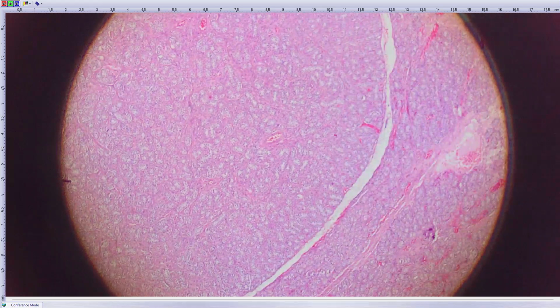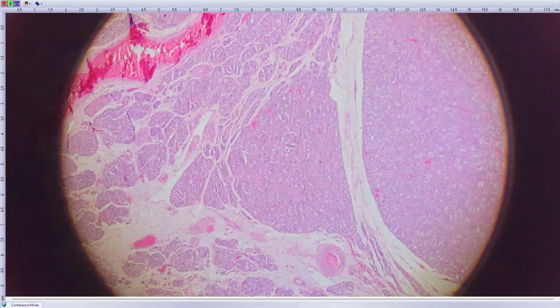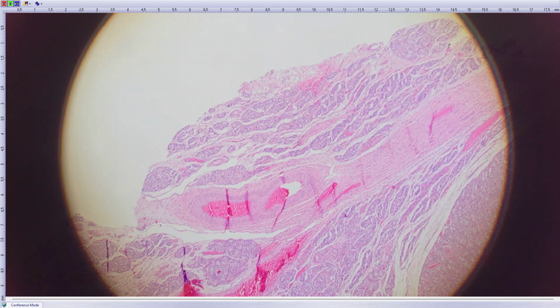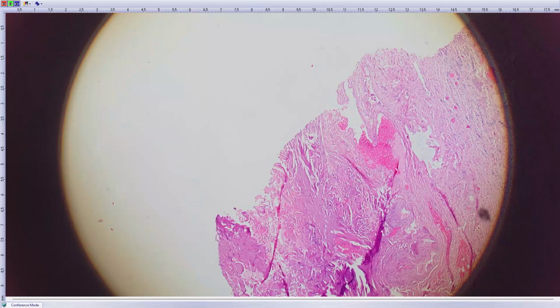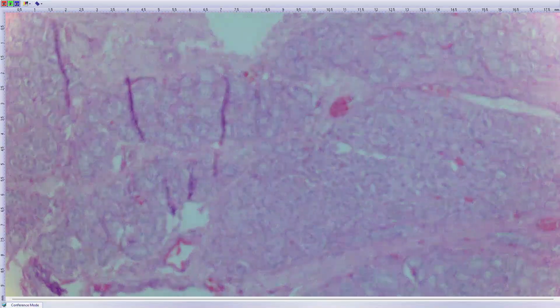I saw cases that were 3 kilograms in weight, and they can be non-neoplastic. It's very often a big one, a huge one. Historically it's called hamartoma, but most hamartomas are neoplastic. Usually there are also Leydig cells present, which were not present in this case, forming a hamartomatous lesion composed of an irregular mixture of Sertoli cells and Leydig cells together. These patients look like women, and they only go to surgery or seek medical treatment because they do not ovulate and do not menstruate, but otherwise they live like women and, according to the data, are satisfied as being women.